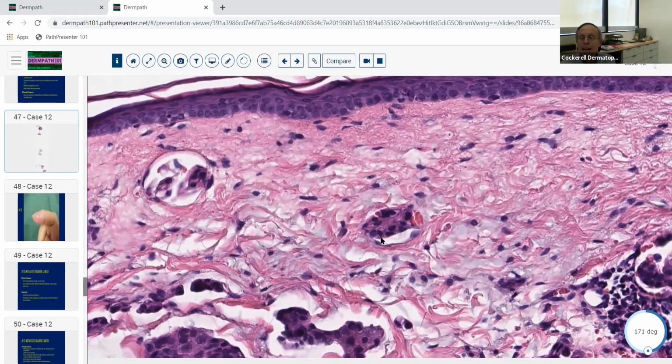And here, you see that little structure right there? That's an actual lymphatic. And this is also a blood vessel or lymphatic up here. You've got the neoplastic cells inside the lumen of that. If you see that, then you know you're dealing with a metastasis. So this is a metastatic epithelial neoplasm. Now, that's as far as you need to go, most likely.